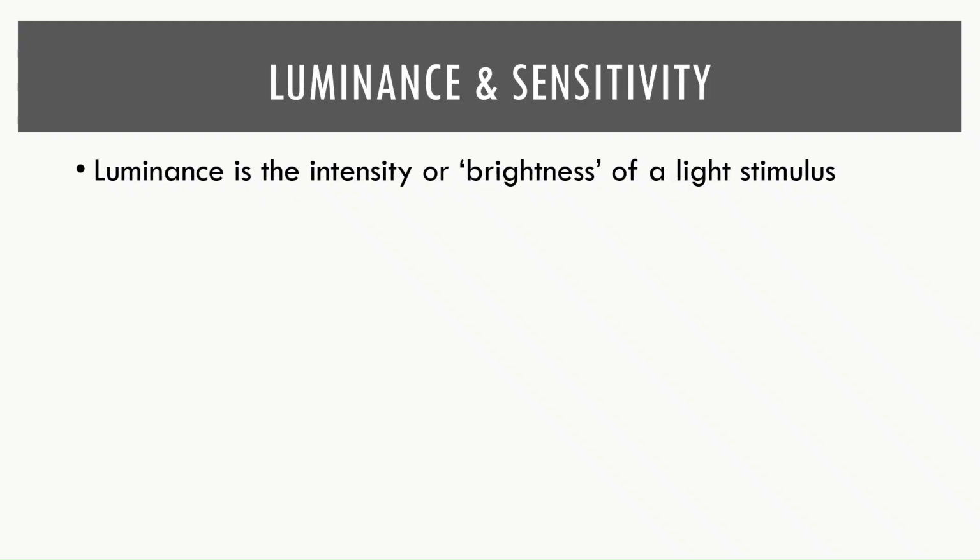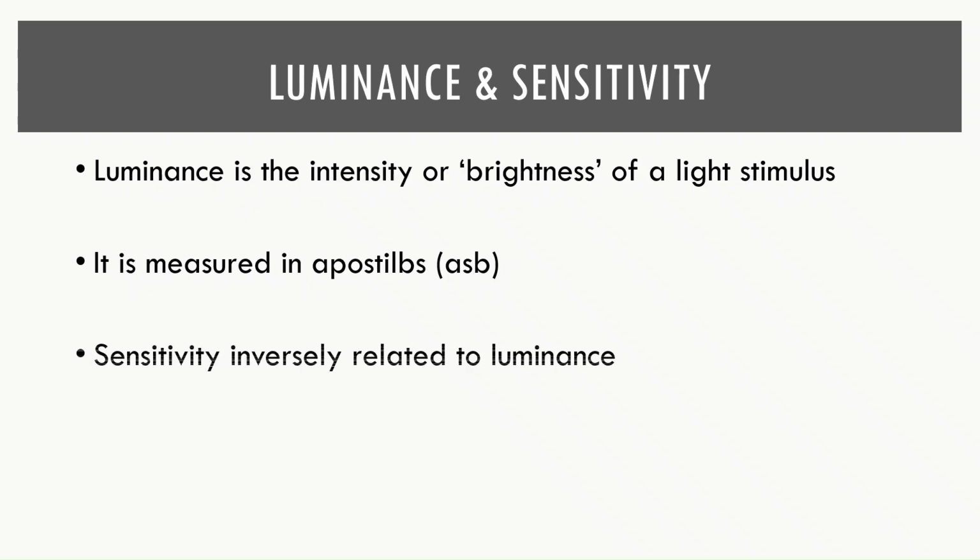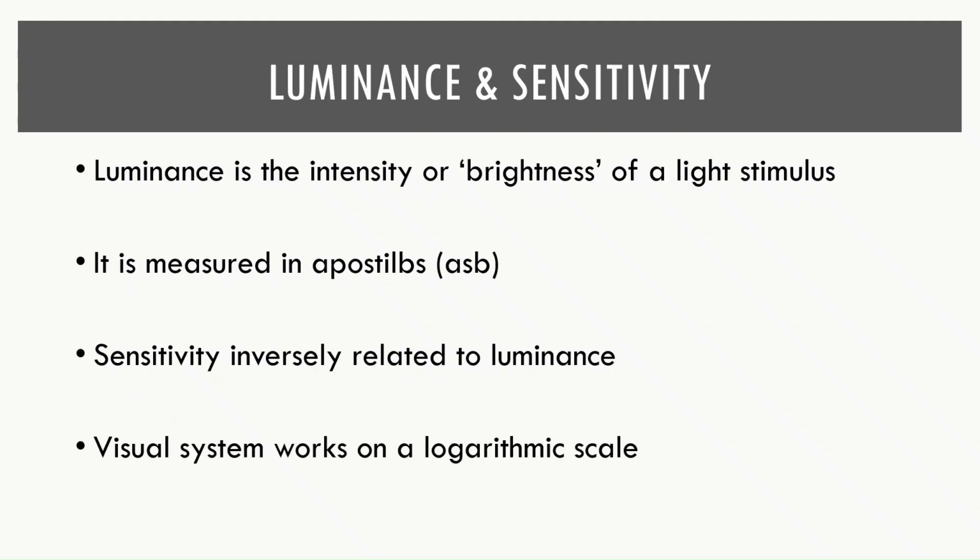Luminance is the intensity or brightness of a light stimulus. It is measured in apostilbs. Sensitivity is inversely related to luminance. The eye responds logarithmically, not linearly. That's why perimetry uses log units. It magnifies early defects that would otherwise be missed.